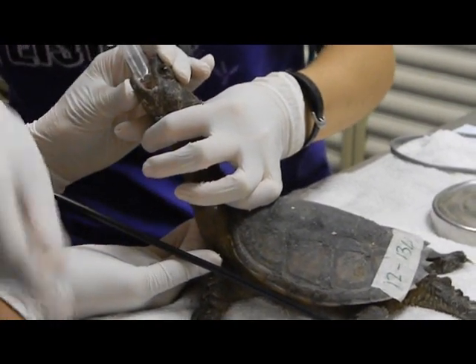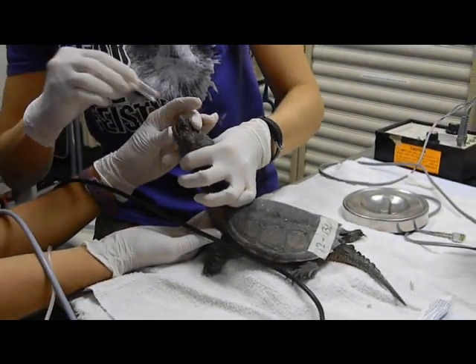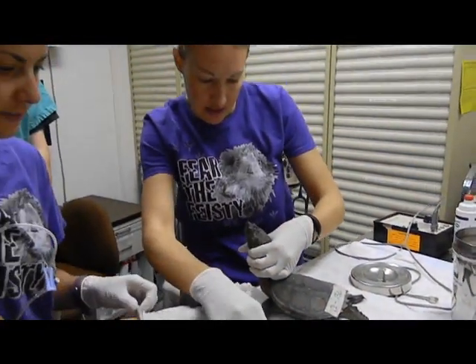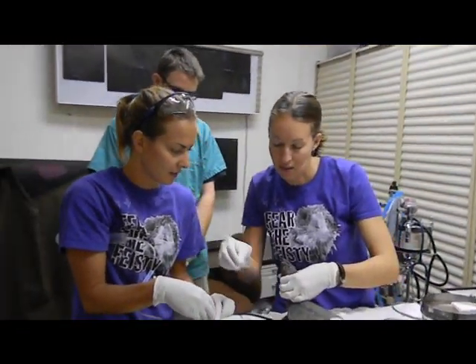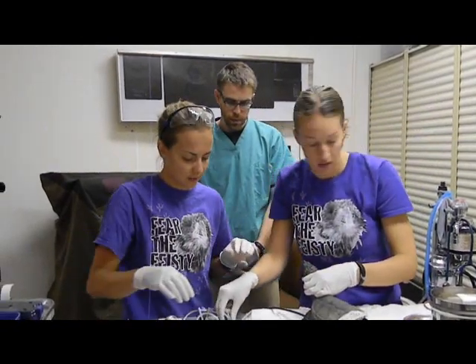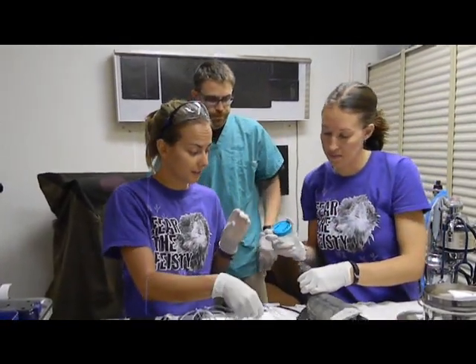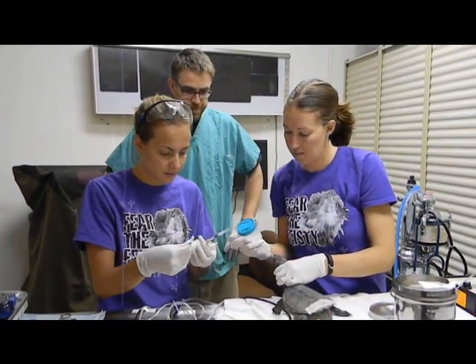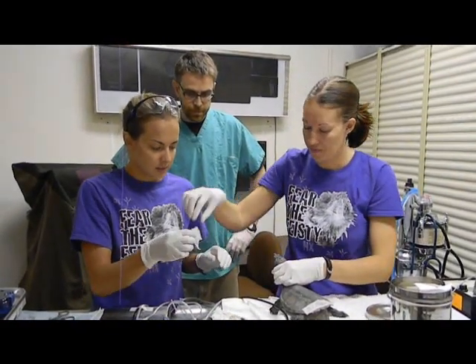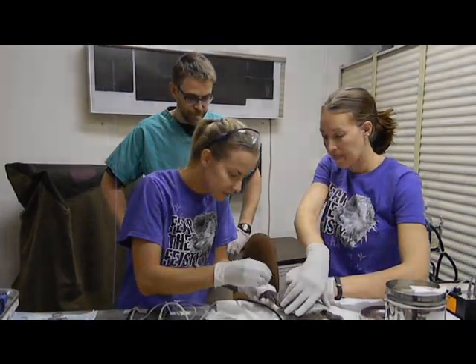Oh, a little bit. Okay, I'm going to pull that. How are we doing? He says I think I got a little more sedate — I've got his drugs here. Okay, that's great. There. Okay, thank you.